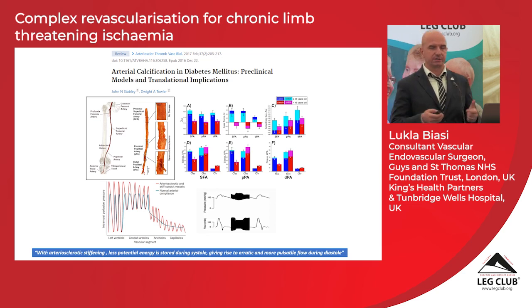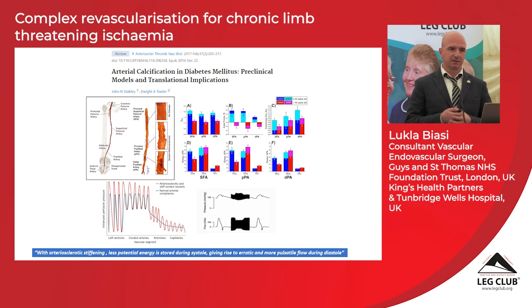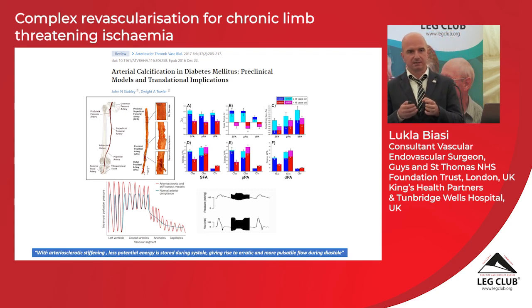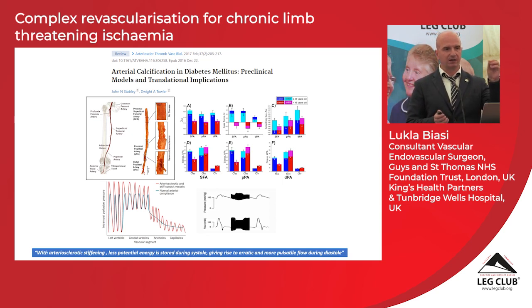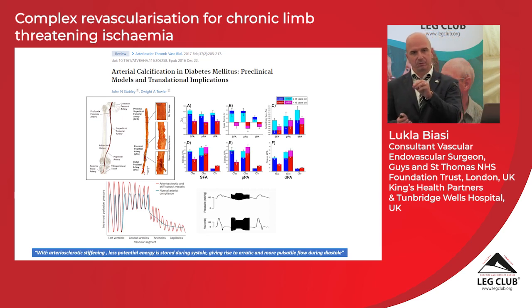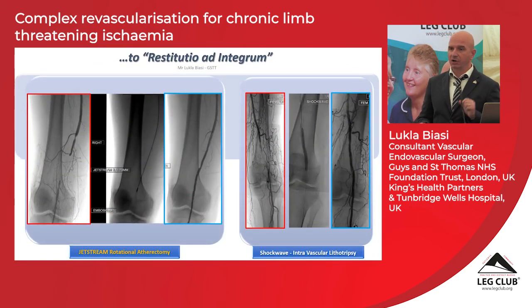You may have heard, especially in heart stenting, that we use either balloons or stents that deliver drugs that try to treat the artery itself, preventing the re-narrowing, the restenosis of the artery. That was called drug-eluting technology. We are now moving from that to the next step, which is improving the vessel compliance. We call that vessel preparation. And the technology comes to a great help.